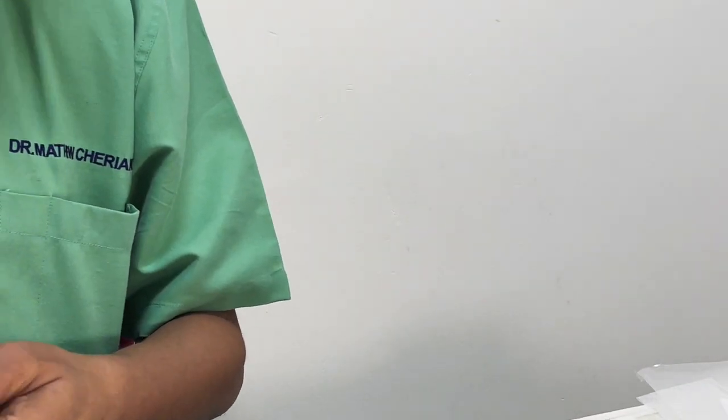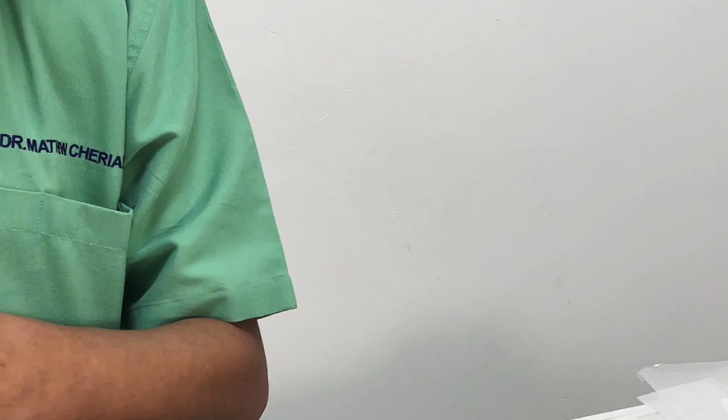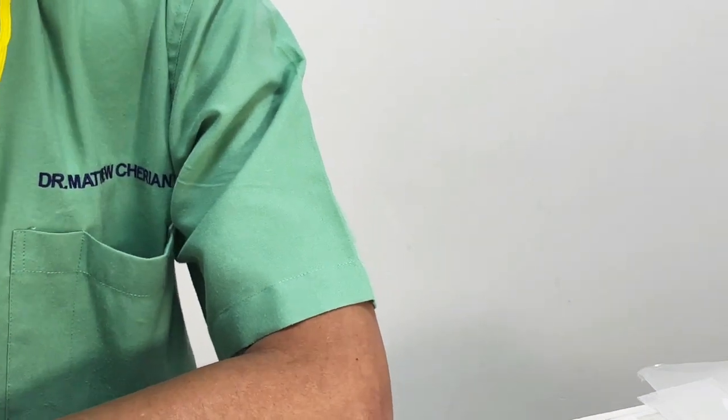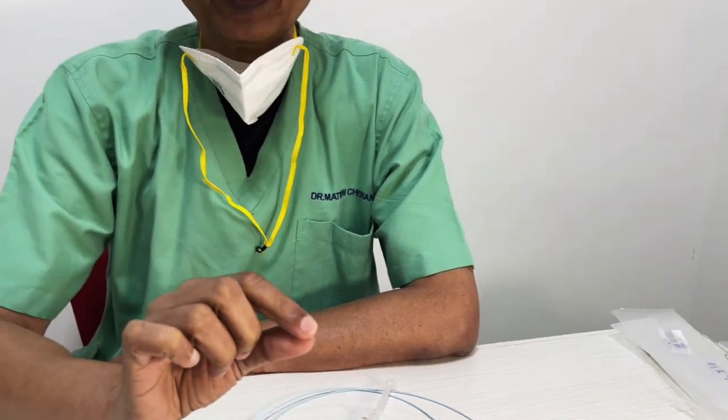So the Amplatzer plug 4, similar device, exactly the same. The only difference is it can go through a microcatheter, so it's smaller. It doesn't come for vessels which are more than 6 mm, because you can't get a 50% oversizing. Very good tool if you want to put it in the GDA, and you want to make sure it doesn't protrude into the hepatic artery. For example, when you're doing a TARE-like procedure.